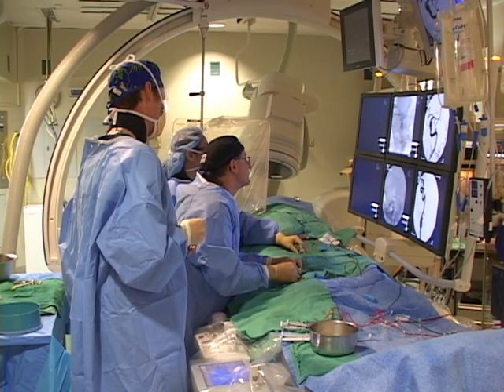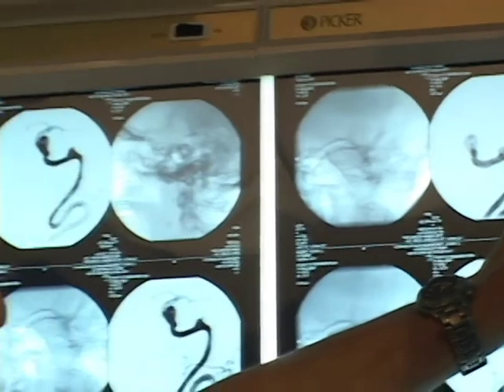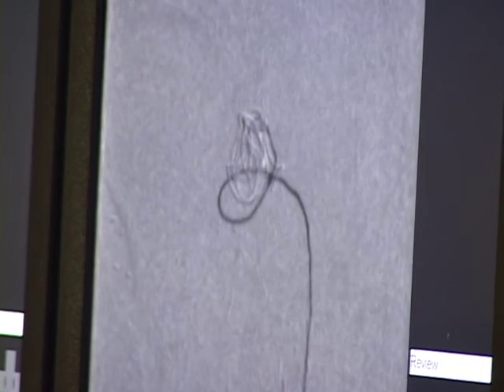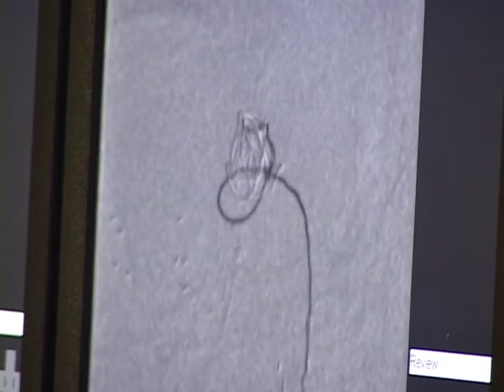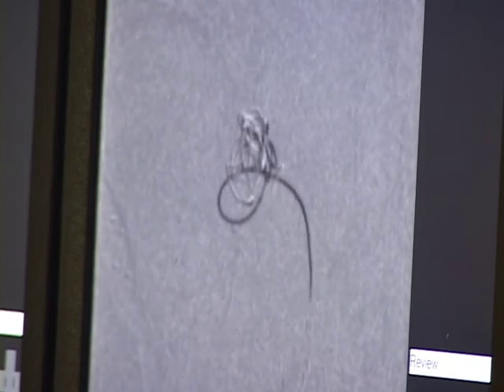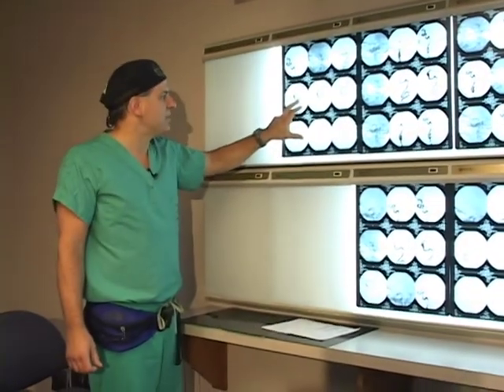This particular coil allowed us to frame the aneurysm very well without any compartmentalization or asymmetric filling of the aneurysm. This also allowed us to produce a more stable basket for subsequent placement of additional coils. After placement of the first 360 Matrix coil, we were then able to subsequently place 2 additional ultra-soft 360 Matrix coils, which were used as filling coils instead of framing coils. Again, a unique added feature that was not previously available with the original Matrix line. The final result was quite good, with near complete occlusion of the aneurysm and preservation of the parent artery.